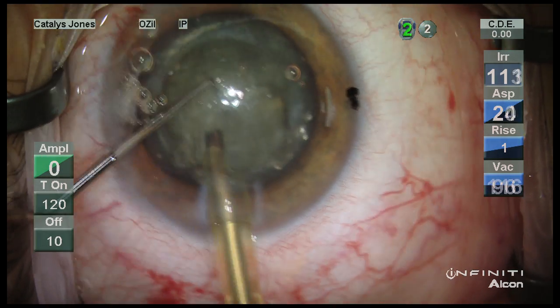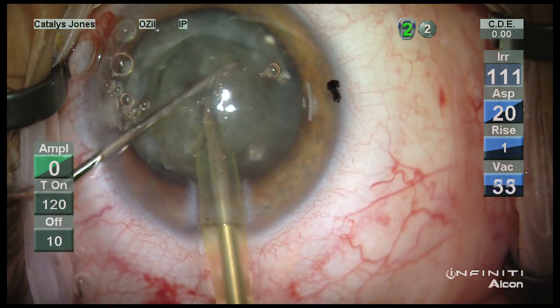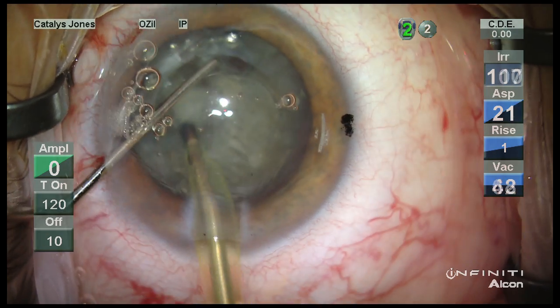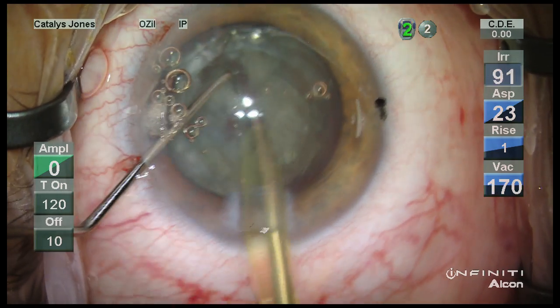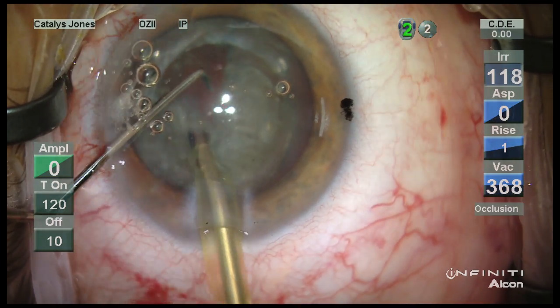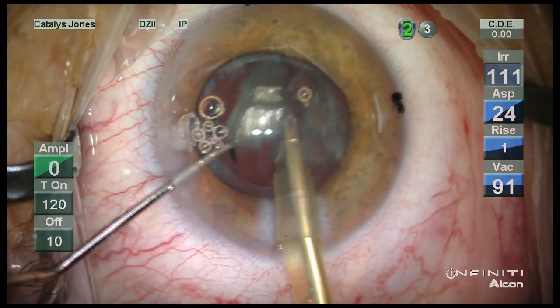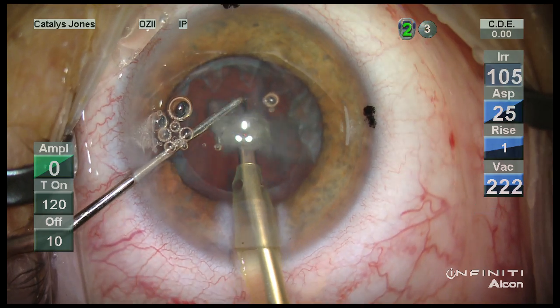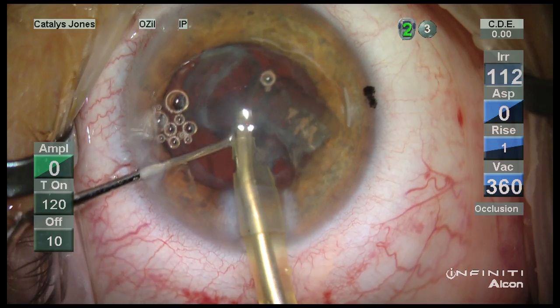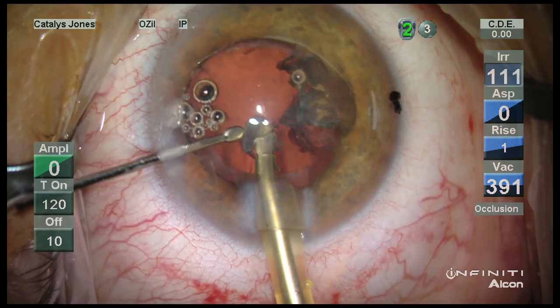The material is then separated using a vertical chopper and the phaco tip in this case is a Dewey radius tip 700 microns from MST. This phaco tip gives me an added element of safety as well as the ability to readily purchase material that's been softened and evacuated largely using aspiration and vacuum with some gentle mechanical assistance from my second instrument.